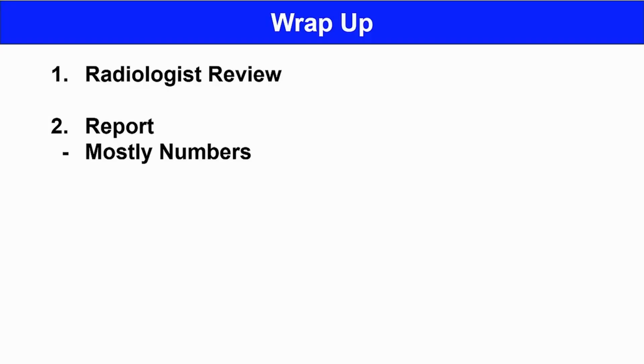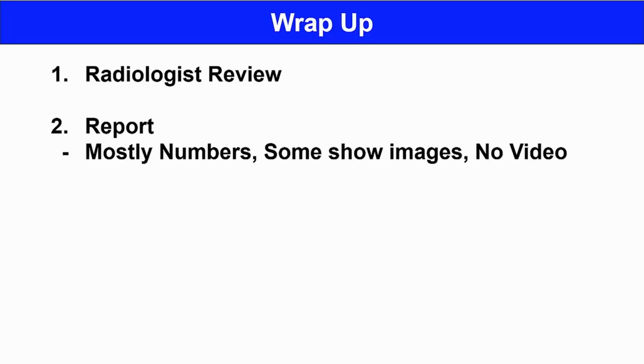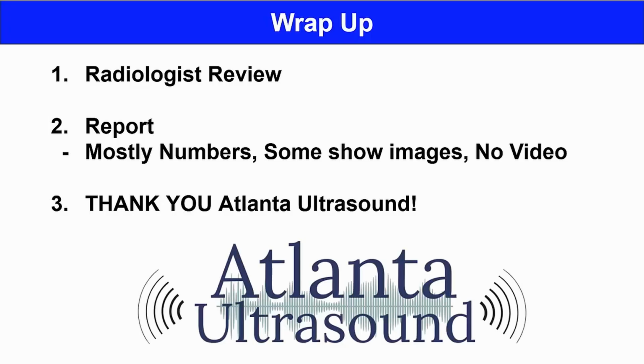Of course, the patient never sees all the stuff you just saw in this video. Some clinics won't even give you still images, much less recordings of the proceedings, and they usually won't even let you record your own. So again, huge thanks to Atlanta Ultrasound for allowing me to share this with you.